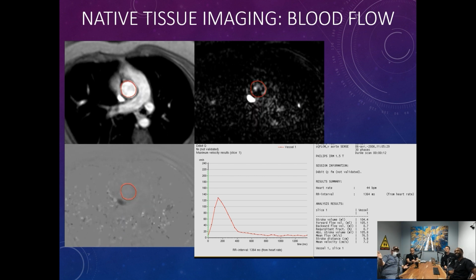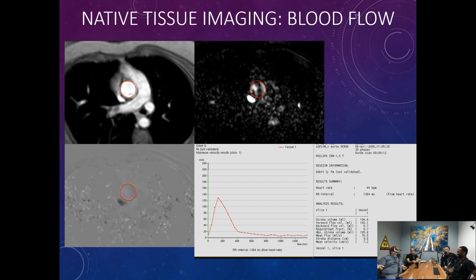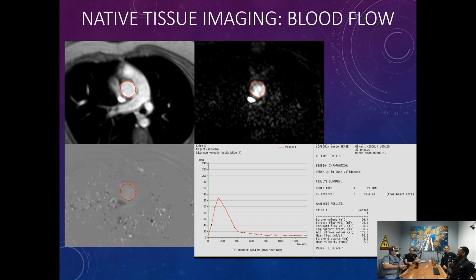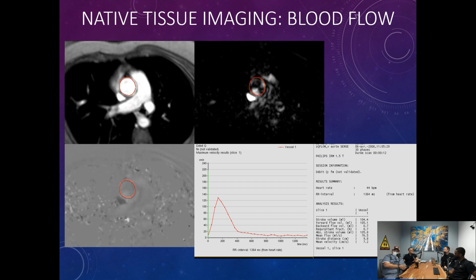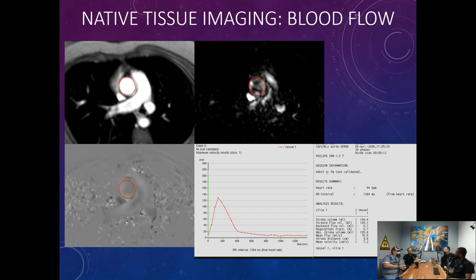I mean, to get into phase aliasing, we could talk about the true nature of reality and quantum electrodynamics and field theory and really dig into that. If we really, we would. To simplify, it's white blood imaging. Basically, and it does exactly the opposite of fast spin echo, where the blood is black.